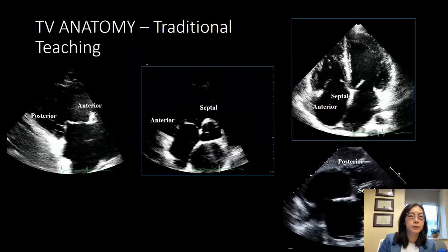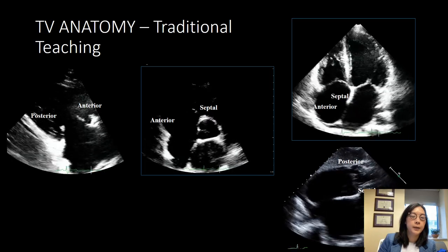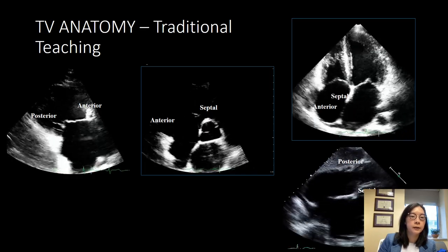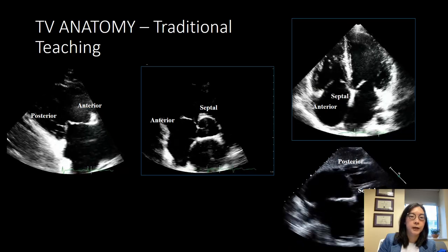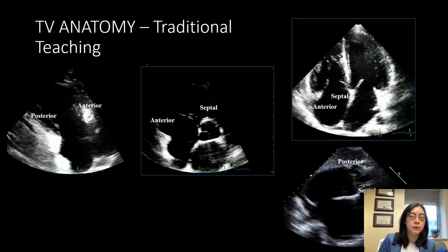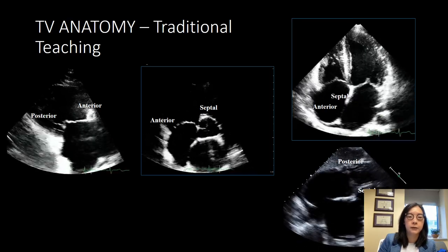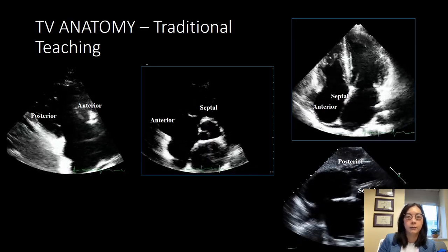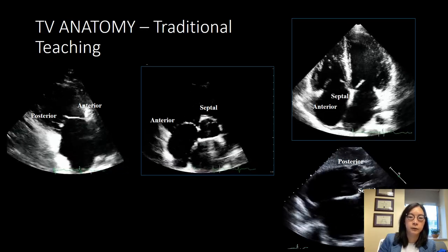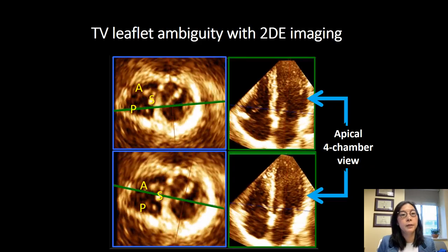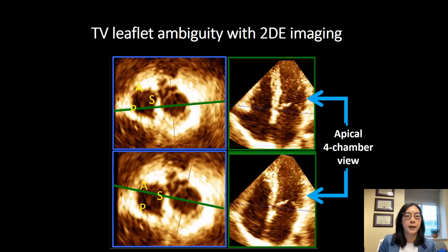How do we identify tricuspid valve anatomy? Traditionally, in the RV inflow view, the anterior and posterior leaflets were identified. In the short-axis view with the RV inflow and outflow, you've got the septal and anterior leaflet. In a four-chamber view, you're looking at the septal and anterior leaflet. In a transgastric view, you're looking at septal and posterior leaflets. However, we know that on 2D imaging, we can be wrong about how we're identifying the tricuspid valve anatomy.